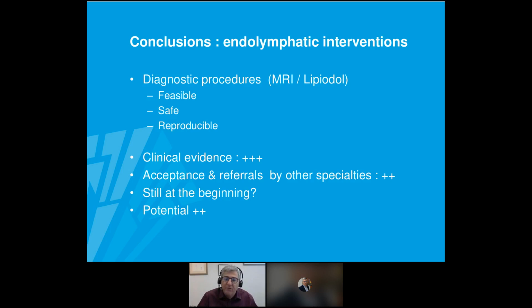If you want to do a liver lymphangiography, of course, the distance between the skin and the wall of your right or left portal vein is longer in most cases. Even in children, it's longer than the length of your spinal needle. So in these cases, we typically use a Chiba needle, which has a length of 20 centimeters. Of course, you can also use this Chiba needle for groin puncture, but it's more handy to use a very short spinal needle. Thank you, Geert.